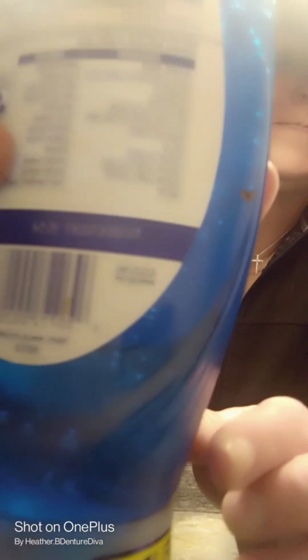So moving along. There's a lot of gigantic words. I'm going to take a picture and put it up here for you guys to see. A lot of this is scent. Stabilizes formula, thickener. The only thing that provides cleaning is sodium lauryl sulfate. That's it. And water holds ingredients together. But all the other stuff should not be put in your mouth. I doubt you'll be able to see this right now, so I'll pop it up here for you.